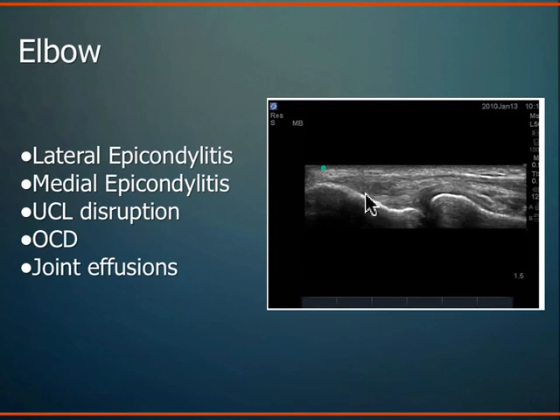So tennis elbow is really a tendon disorder. And so epicondylitis is a little bit of a misnomer, but what you're dealing with mostly is tendon pathology or tendon abnormalities. And so in tennis elbow, a lot of times you can visualize that tendon quite nicely. And this tendon has this fluid collection here, disruption of normal tendon fibrillar pattern. It's a little bit thicker. So this is a tendinopathy or probably a chronic tennis elbow. And you can see that quite nicely here.